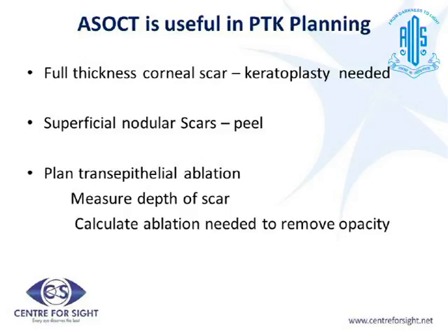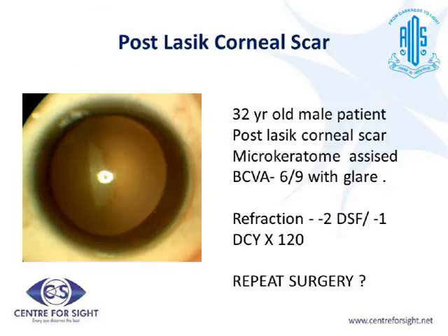Another application is the use in PTK planning. So whenever there is a corneal scar, we need to determine the depth of the scar to decide our management protocol. Like this is a case where you can see that this is a large central corneal scar.